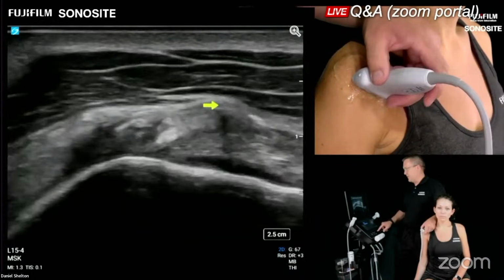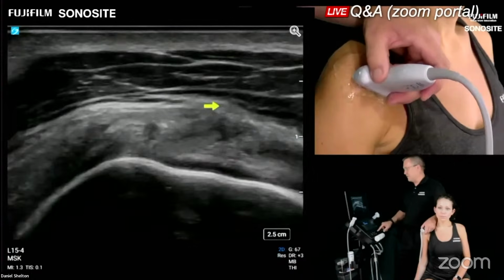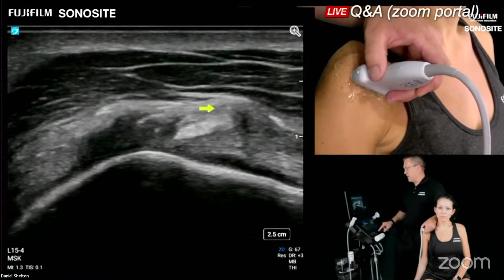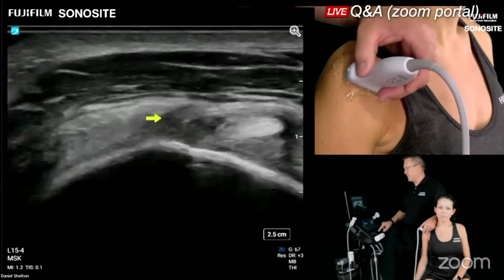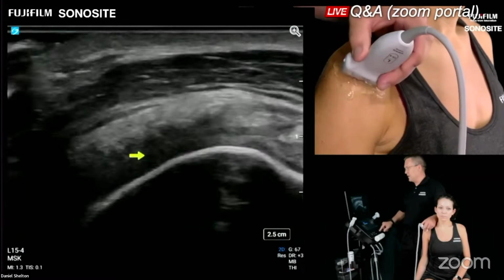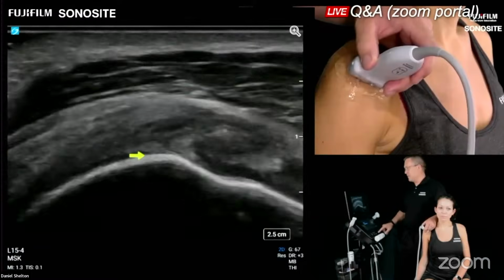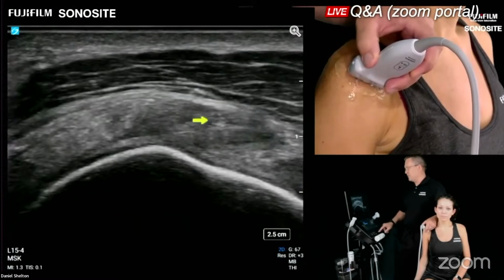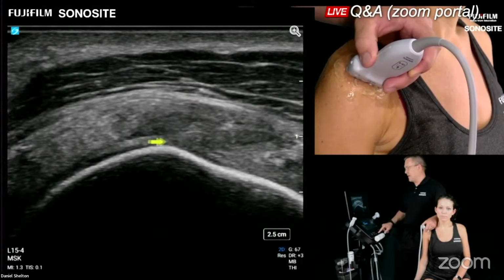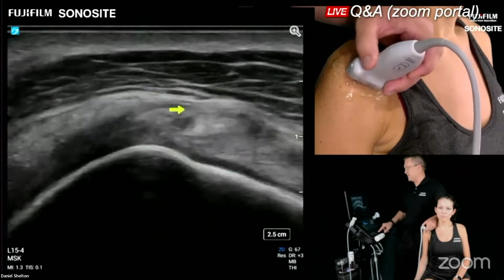Basically, you can see with very little toggling of the transducer, using this angle artifact to my advantage, I'm going to follow this stripe above the biceps to the anterior footprint of the supraspinatus here. Okay, and then I'm also going to be following some of those fibers to the superficial margin of the supraspinatus too. So these fibers really envelop the anterior supraspinatus here like a sling.